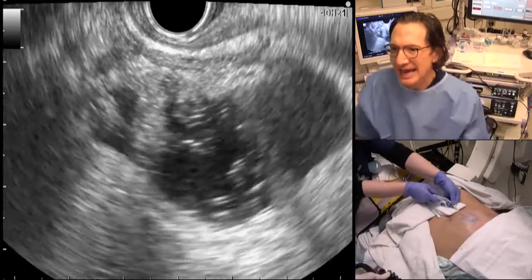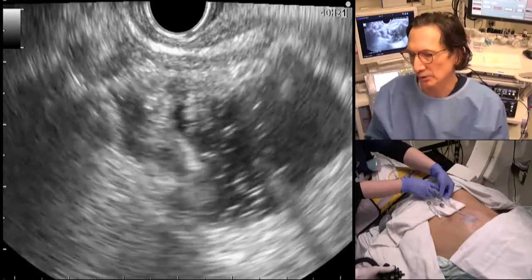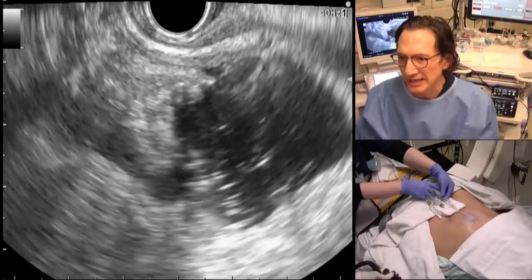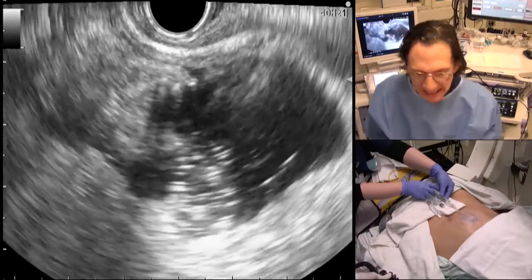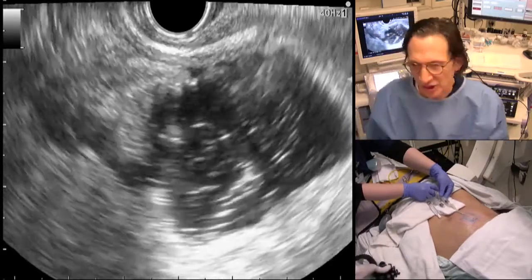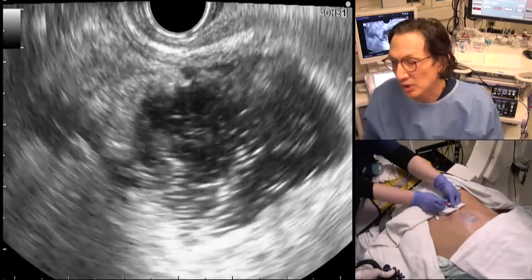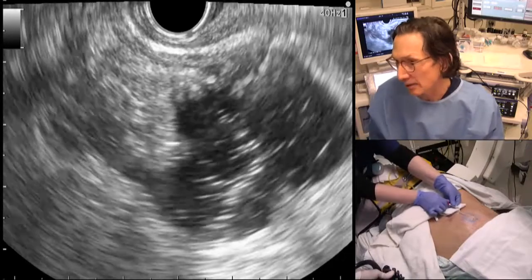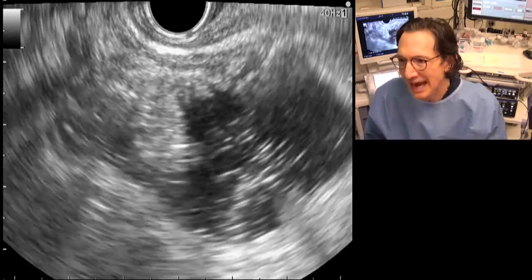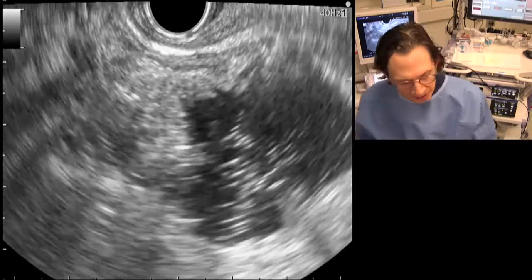So in essence, what we're trying to do, and we're all very comfortable draining pseudocysts, right? We've all done this, most of us, and it's very routine. It's been around for two decades now. But what we're less comfortable with is draining the gallbladder, and that's good. The reason for that is because we're dealing with a structure that's not adherent, and so there's a risk of leakage here, and it's bile leakage into the peritoneum, not the retroperitoneum, the peritoneum. So the stakes are very different when you drain the gallbladder than when you drain a pseudocyst.